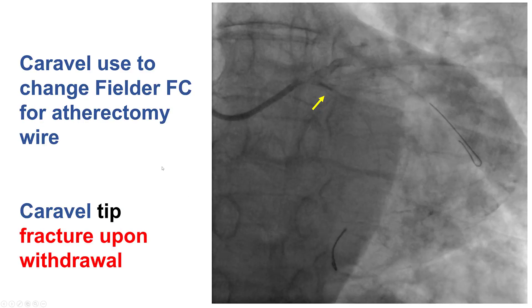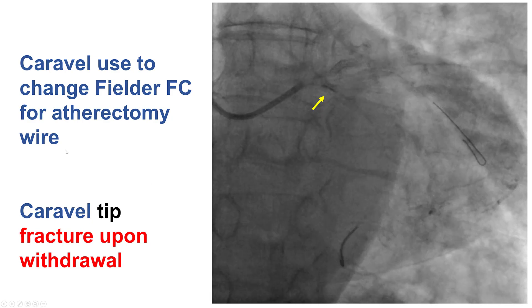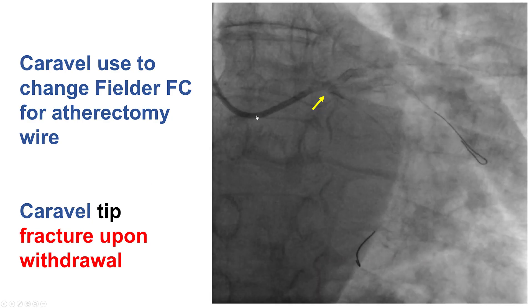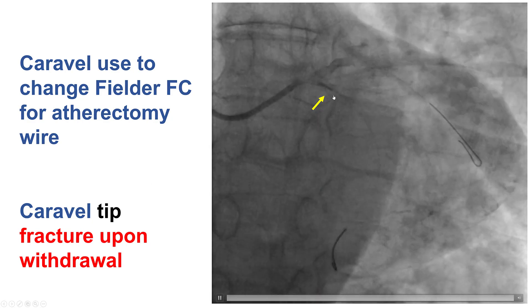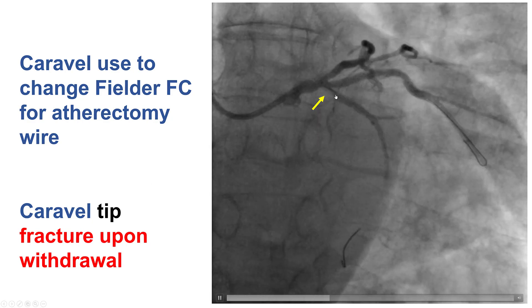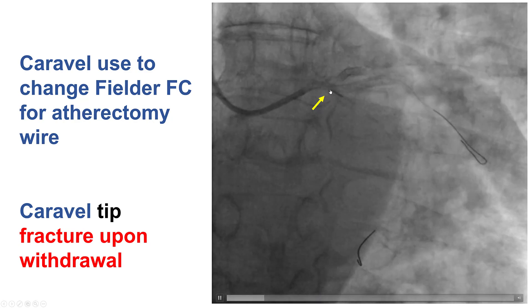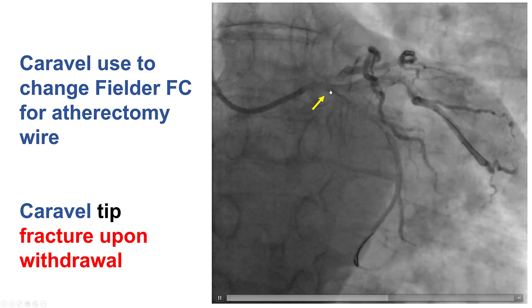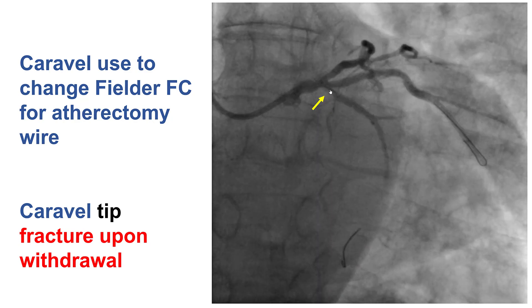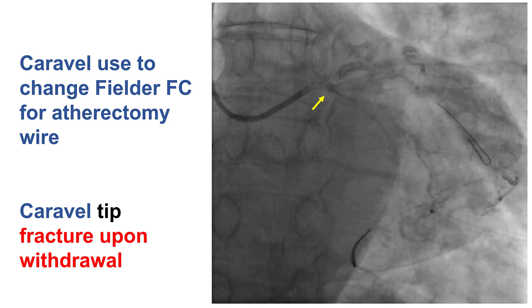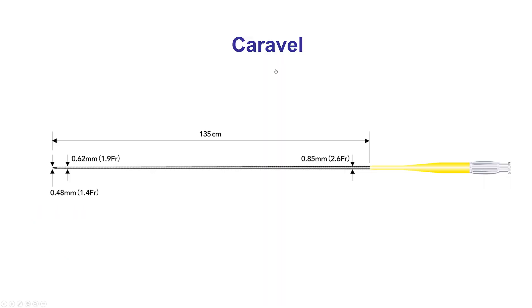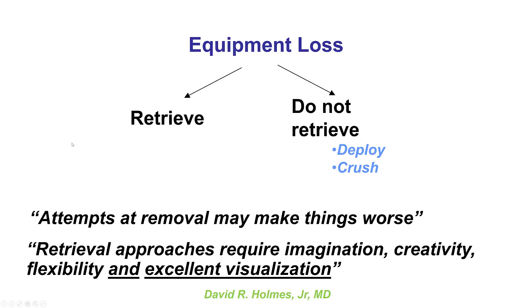Unfortunately, when we tried to remove the Caravel, there was a snap and the Caravel came back — however, the tip remained inside the vessel. We had a fracture of the tip of the Caravel microcatheter staying inside the vessel. This happened even though we did not twist it, but likely because of the significant disease at the ostium of the circumflex.